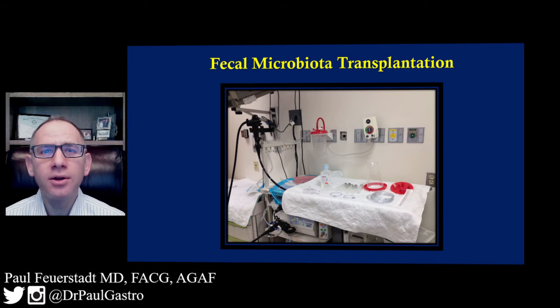Once that fibrous matter is removed, about 5 or 6 60 cc syringes are drawn up of the effluent, containing mostly the bacteria as well as the other microscopic contents of the feces. Following this, a colonoscopy is performed, with passage of the scope to the end of the colon and into the terminal ileum.